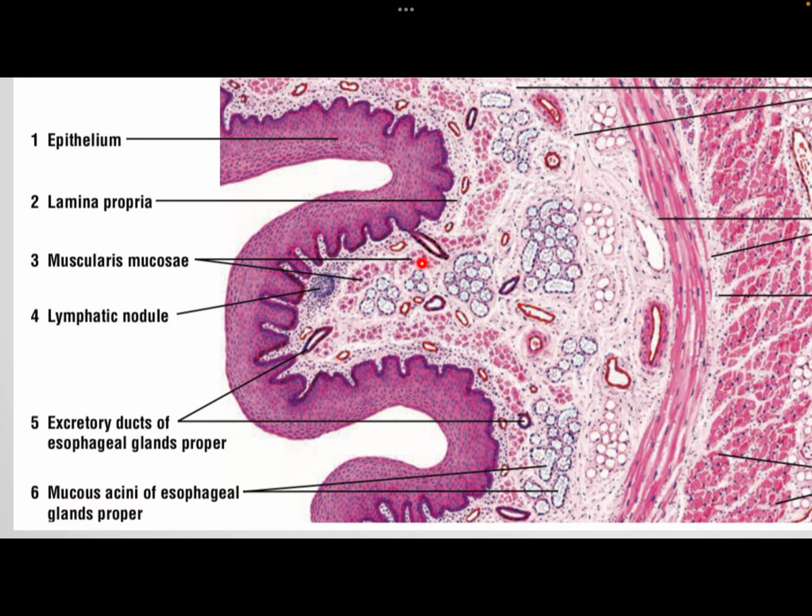So these are all the muscularis mucosa. You see a full layer of smooth muscles following your mucosa, the epithelium lining, the lamina propria, and then the muscularis mucosa. And we talked about why we have this in the introduction video. Now, following that, we can say that three of them are my mucosal lining, and this is followed by the submucosa. What do I have in the submucosa?